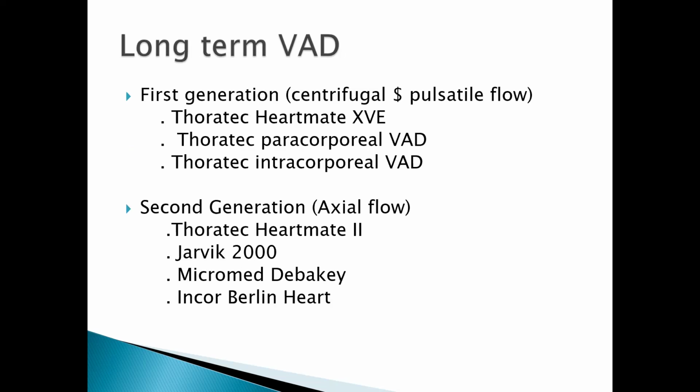And for the long-term ventricular assist device, you have three generations. They have undergone some generational changes. The reason for this generational change is that initially the first set of machines were bigger, and over time they have been trying to produce machines that are so small that they can actually be compatible. So that was what led to these generational changes.